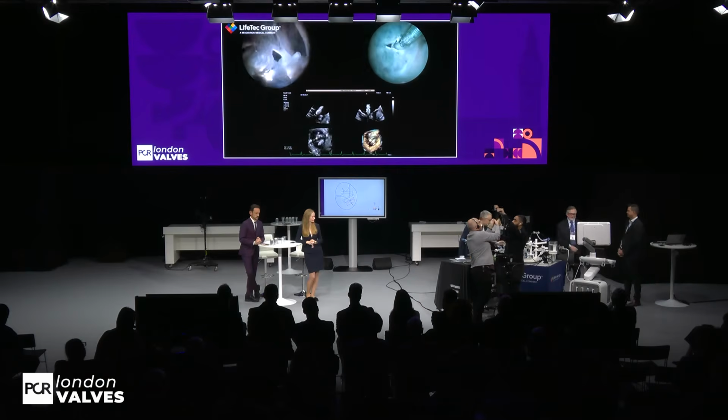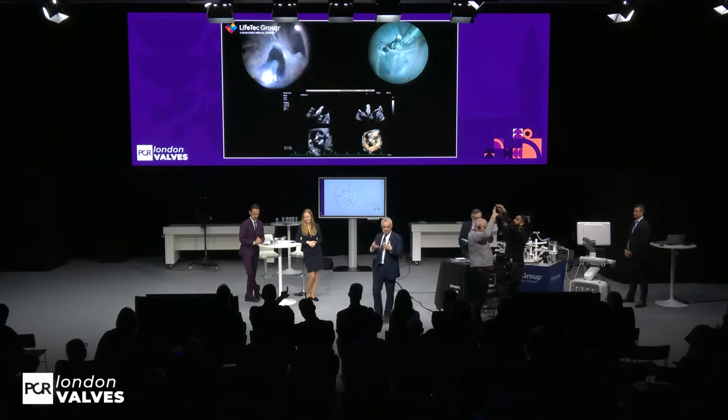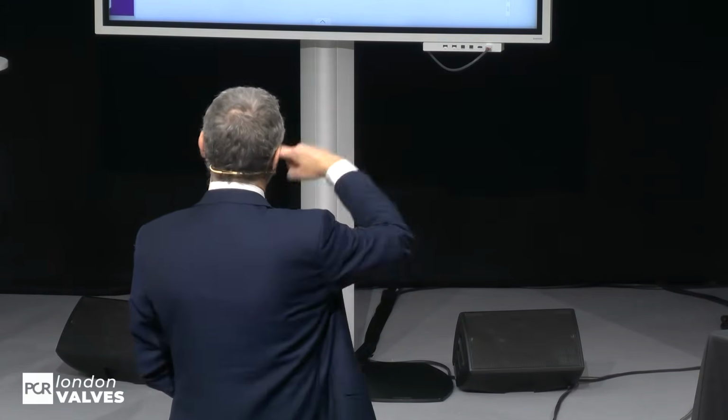It is a real heart. Which kind of animal is this? It's a pig, a large pig. It's the right heart of the pig, which is pressurized, and we have cameras inside. And what you were seeing, can we have it again, the LifeTech, guys? Thank you. Not this camera, the other one.